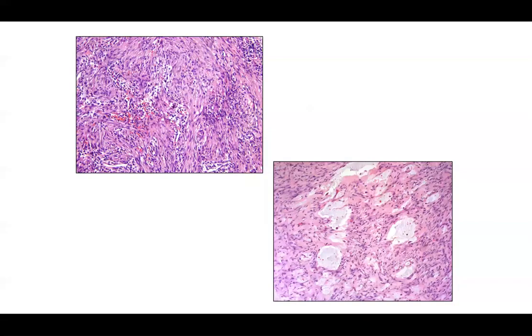So just more examples of these kind of areas where you have microcystic formation, more of that tissue culture-like appearance, but it's got abundant spindle cells in other areas with elongated fascicles, and it takes on a nodular appearance. So that's your nodular fasciitis.